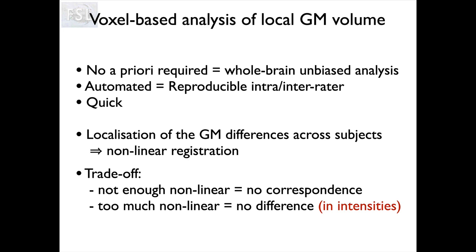And it combines two different things together. It combines together registration and segmentation. And that's important because neither of them are typically perfect. And by combining them together, we actually can get the best out of both worlds and have them compensate for each other. And so there is a trade-off that we have by incorporating both things. It makes the interpretation a little bit more difficult, but again, it gives us a little bit more statistical power. So we can compensate for the fact that our nonlinear registration is not going to be perfect by using the segmentation.